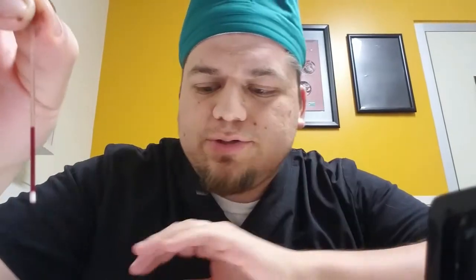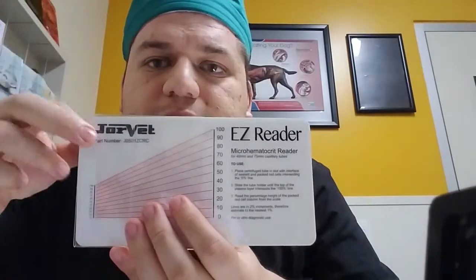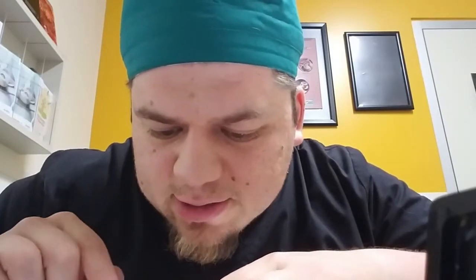We went ahead and spun down the blood for Campeon and I got a nice tube. So now I'm going to place it on this easy reader. The way you do it is you place it right here in this little slit, then match up the top of the plasma to 100%. That'll give you the PCV. I'm going to roll that — and for Campeon, I have his PCV at 42.